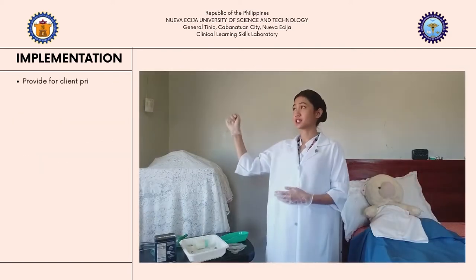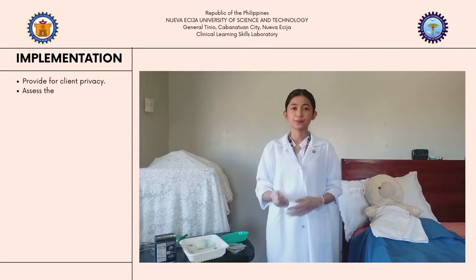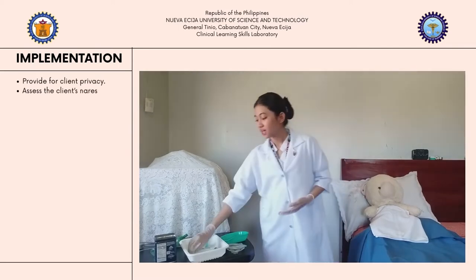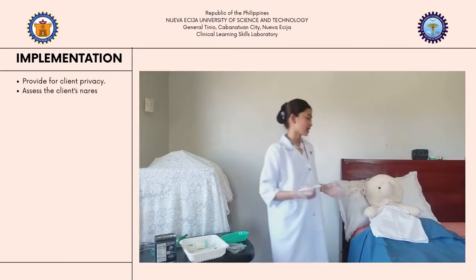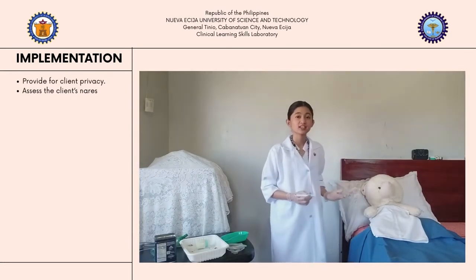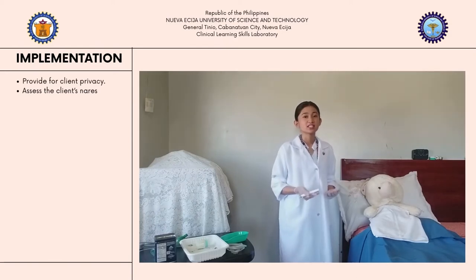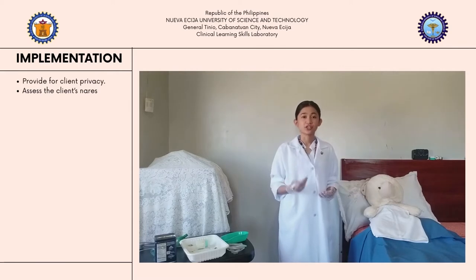Privacy by closing the curtains and the door to the room. Then, assess the client's nares for patency, and we can do this by asking the client to hyperextend the neck if he or she can. Then, assess the nares for intactness or for any abnormalities such as any irritation or abrasion.